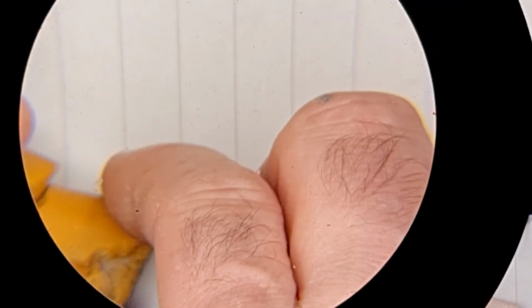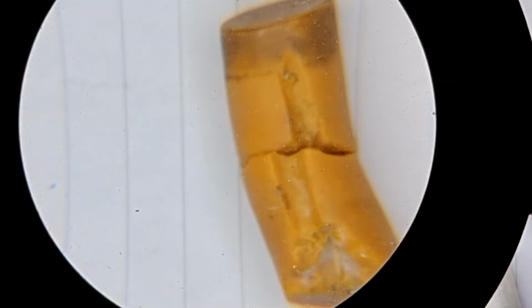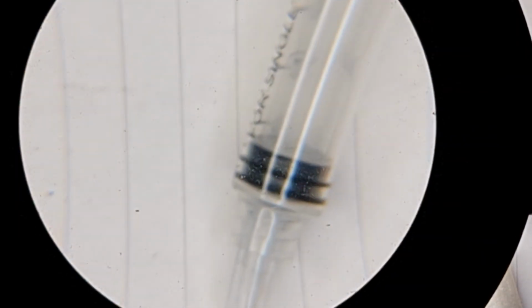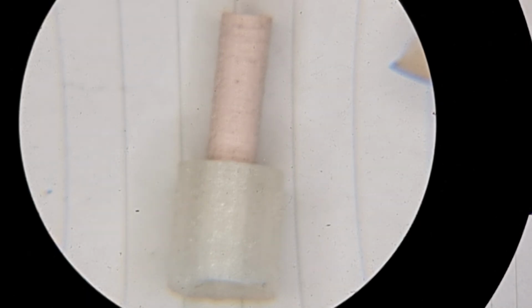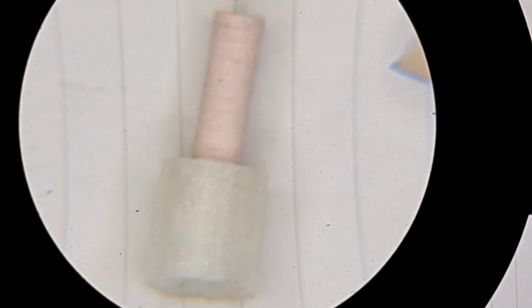I'll just show you the original unit. As you can see, that was very badly damaged through oil and having to remove it, and I injected the silicone or caravan glue with a syringe. So that's how we did that, and that's worked very effectively. So I just thought I'd mention about using these materials. The caravan glue gives a much stiffer dampening than the silicone, and that makes quite a difference to the unit. Even if the flexible plastic coil unit is the same, having a different material here does make a big difference, and the silicone is a much softer dampening than the caravan glue, but both have their uses, I think.